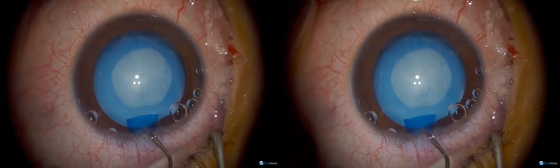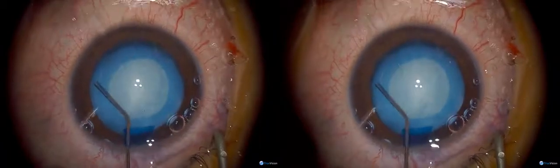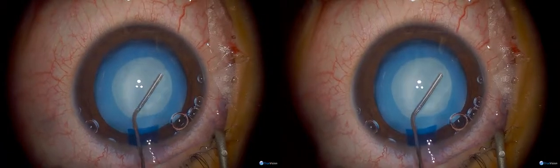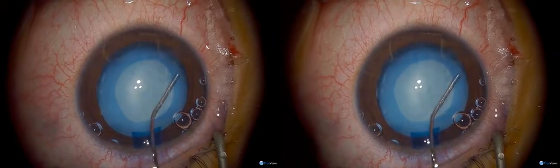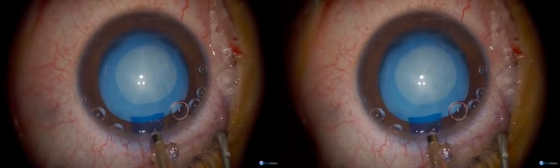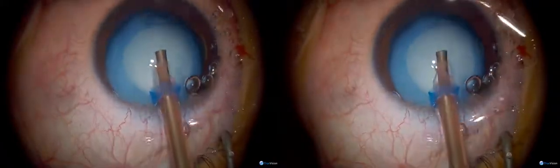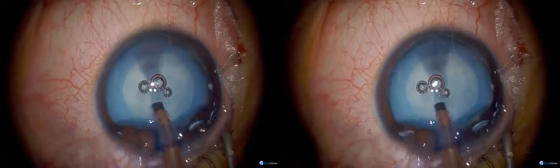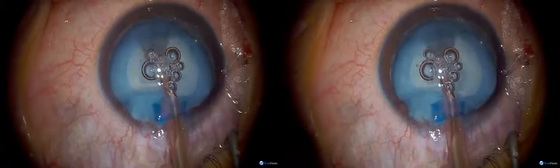And the hydrodissection please. I use the phaco probe — some people just aspirate pediatric cataracts, but sometimes they're much harder than they look. I tend to use the phaco probe because it's a very good aspirator, and if I need any phaco power then it's there.